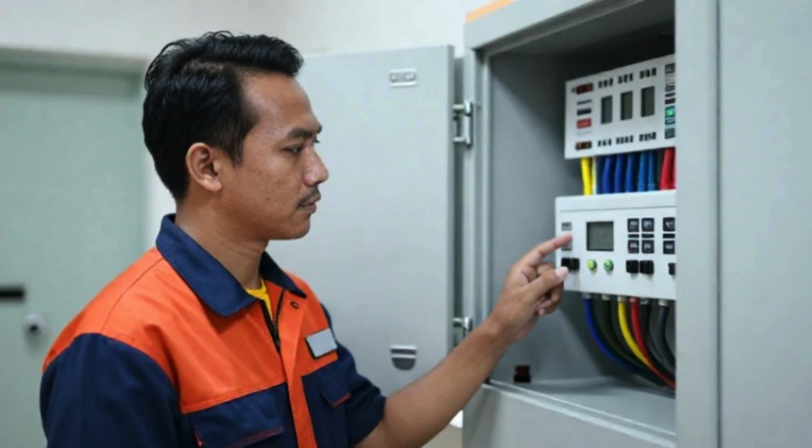Closely related to electric shock is the concept of leakage current. Leakage current is a small amount of unintended electrical current that flows from the device to the patient or to the ground. Although leakage current is usually very small, it can still be dangerous, especially for patients with compromised skin or invasive connections, such as cardiac catheters. Therefore, medical equipment is designed with strict limits on allowable leakage current.